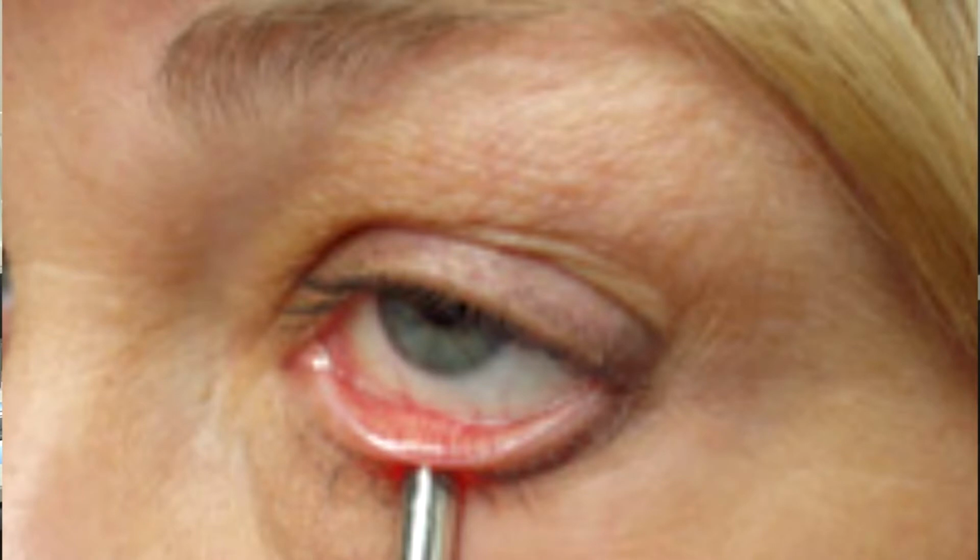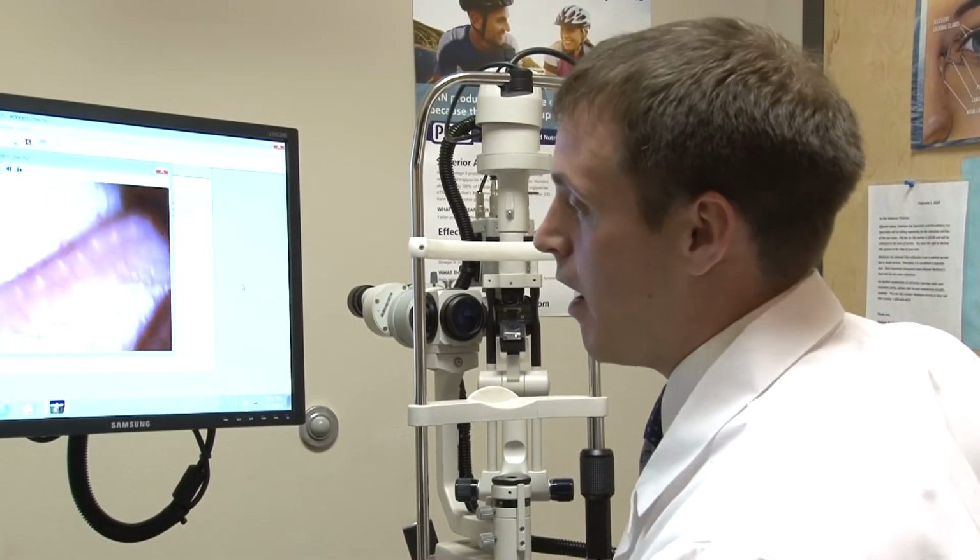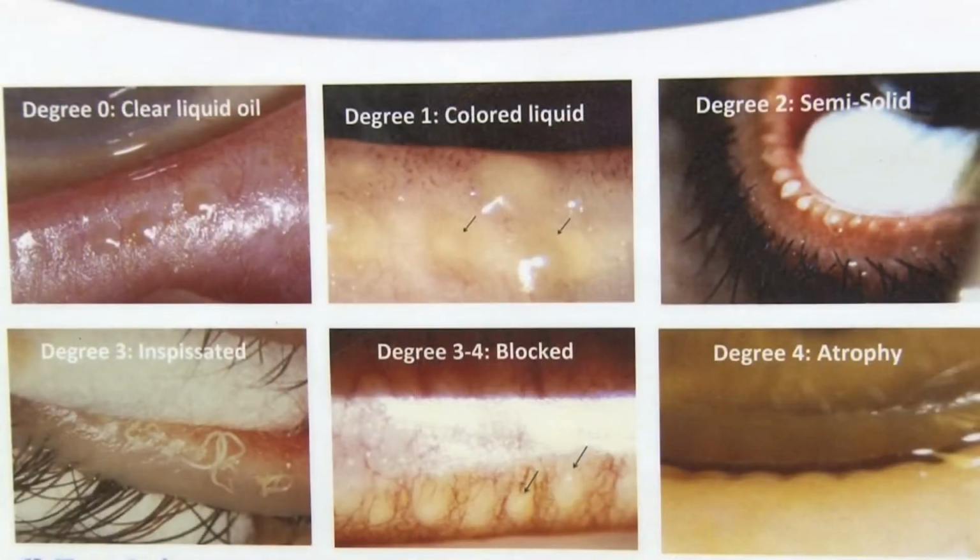Once this has been viewed by the patient, we will then take a transilluminator and place it under the lid of the patient and view the presence or atrophy of the meibomian glands in each section of the lids. Photographs are also taken of this for the patient to see. This is the most powerful photo to show the patient.